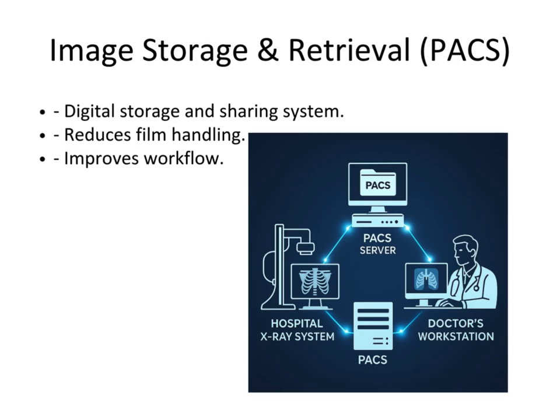Slide 11, Image Storage and Retrieval, PACS. In modern hospitals, radiological images are stored digitally using PACS, the Picture Archiving and Communication System. It allows for easy storage, retrieval, and sharing of images, improving workflow and accessibility for radiologists.